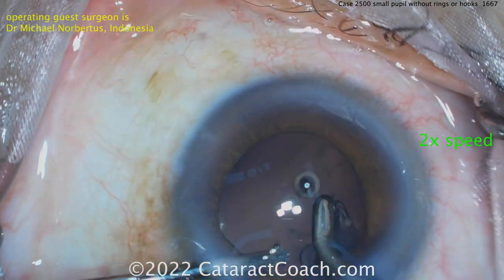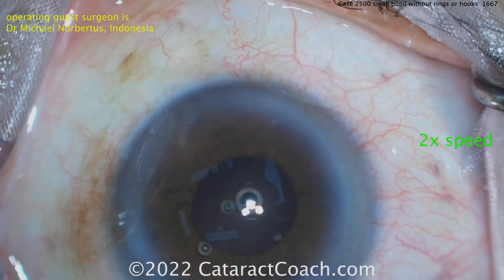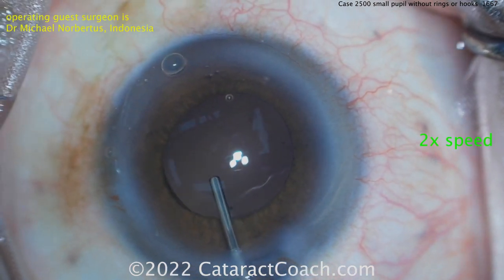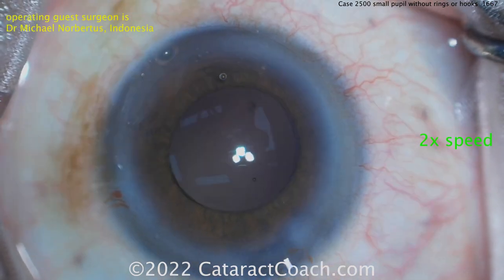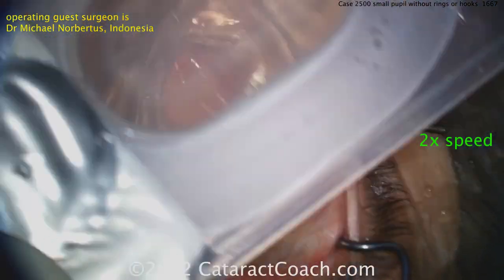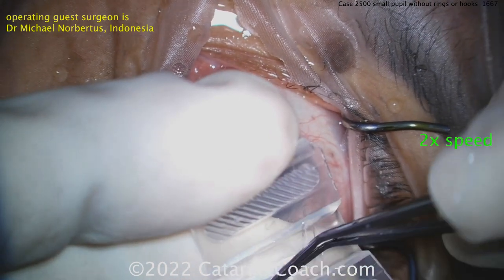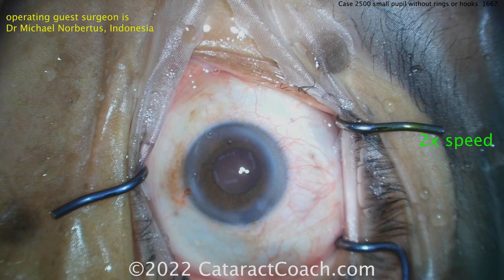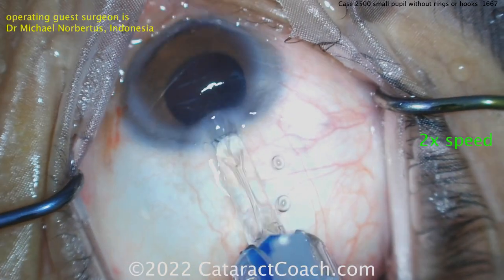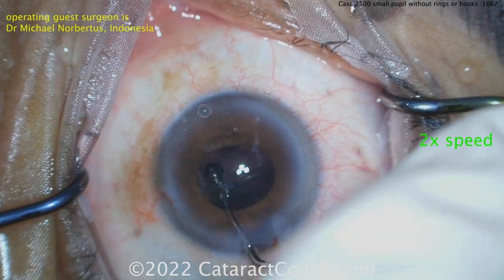Get that lens in and call this a day. This is definitely like a Flomax case - look how small the pupil is. Filling up the bag with viscoelastic, here comes the lens - looks like a hydrophilic acrylic lens since it was sitting there in the saline. Zooming in - here's the lens going in the back, get that dialed in.